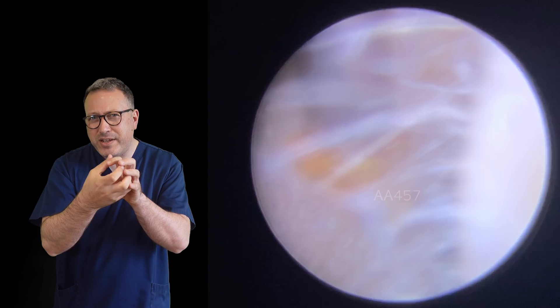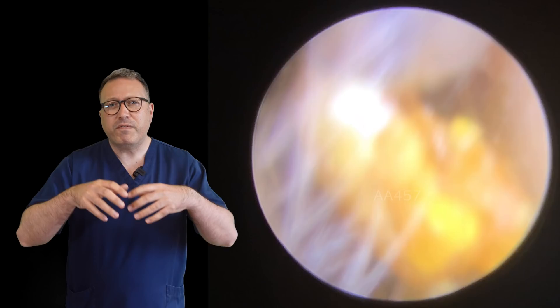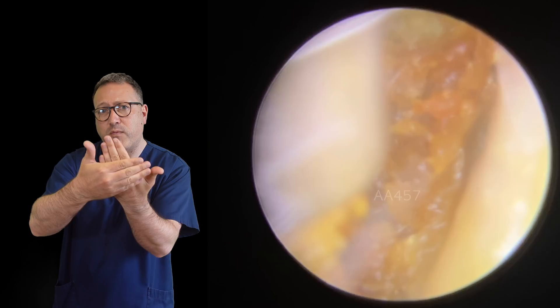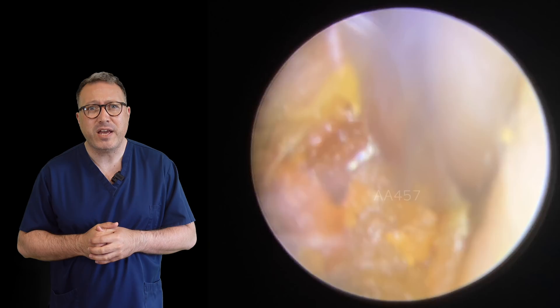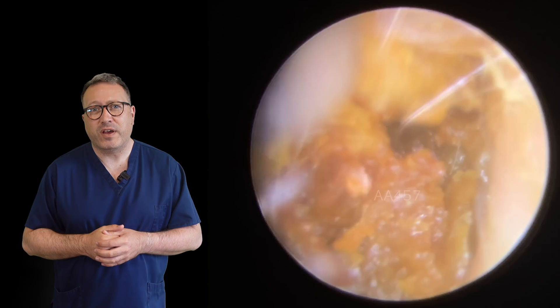But you can see behind that now we've got these longer strips of skin and dry skin material. So we're just taking these little chunky bits away. And then as we go in, you'll start to see these longer skin pieces just sitting just behind that block of wax. What's happened here is we've almost got this layer of skin that's folded over, then a layer of wax, then the skin's folded back and another layer of wax, with all these little bits of dry skin in between. So this is very much a case of unpicking and teasing this plug apart before we can get it out, and those long strips in there are holding and anchoring everything together.